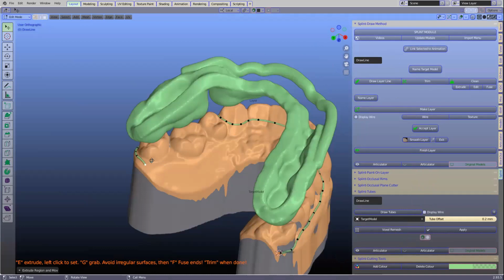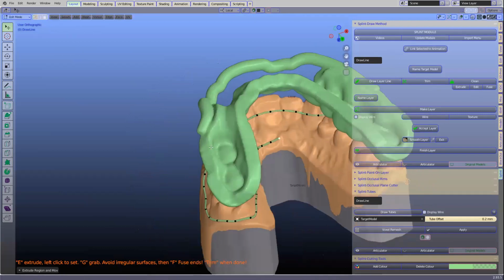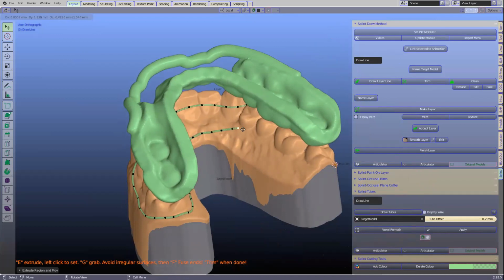So Wolf, explain to me why you wanted this close to your molars. Yeah, because it gives people a gagging effect if it's too far down. If you go to sleep with a device, you've got to make sure it's comfortable. Otherwise, the patient will come knocking on your door.